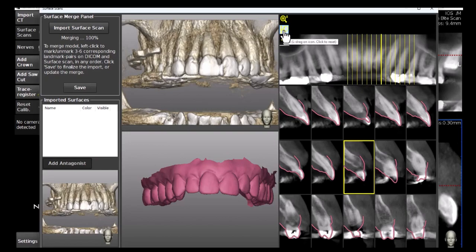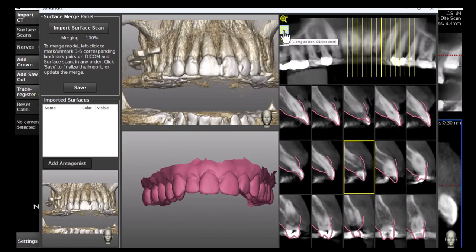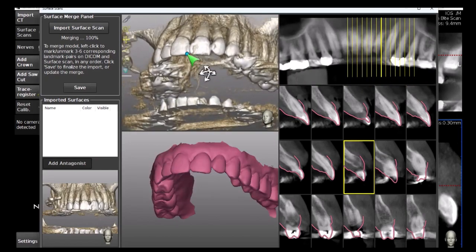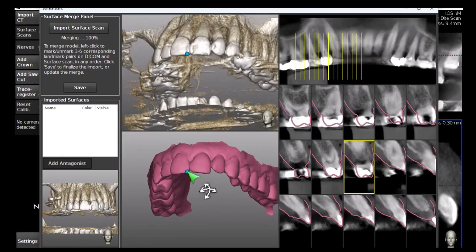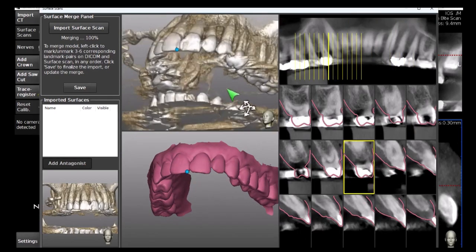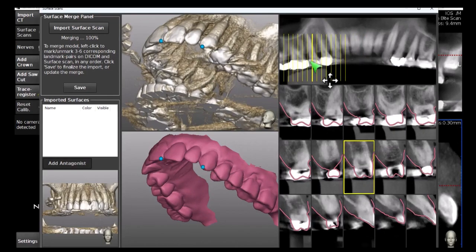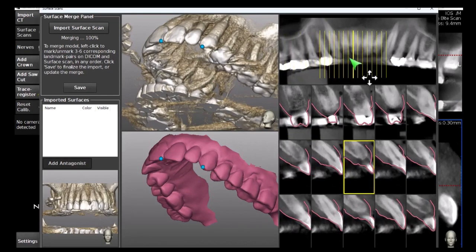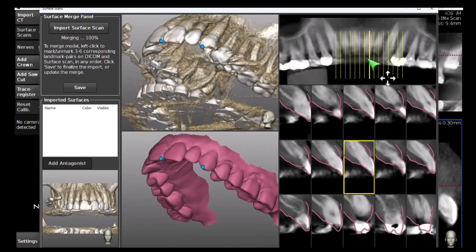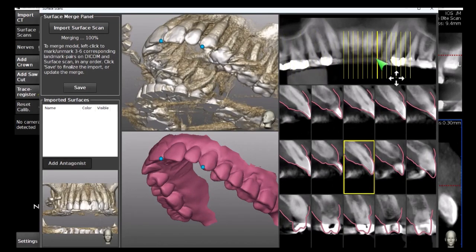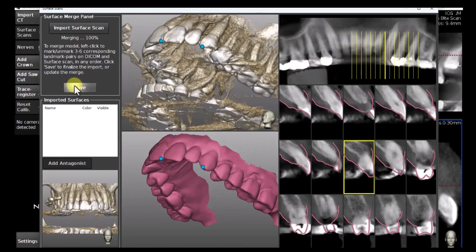The panoramic view's height can be adjusted as needed. Similar to the full manual mode, matching point pairs can be manually added to the DICOM and to the surface scan to improve the accuracy of the AI-based merge. When a satisfying result has been achieved, click Save.